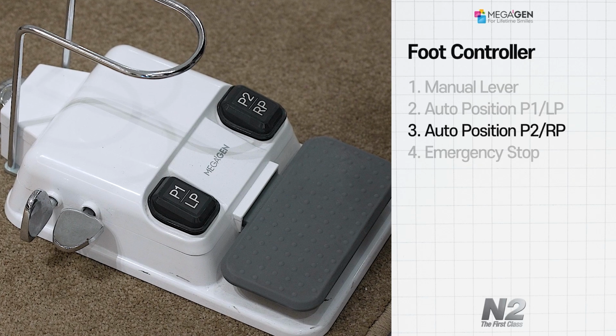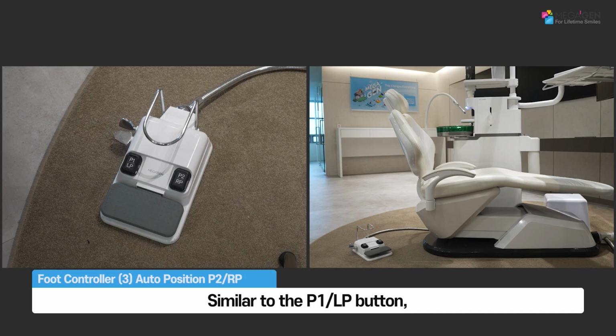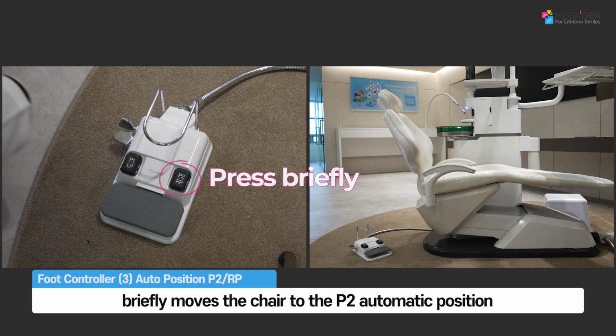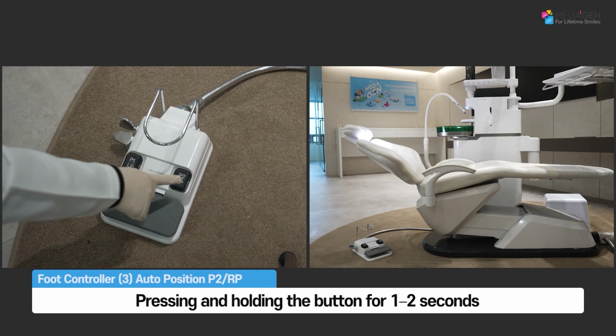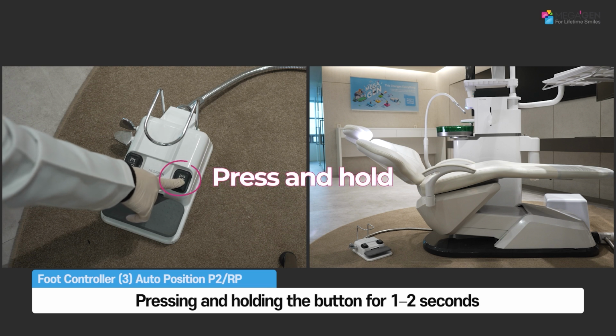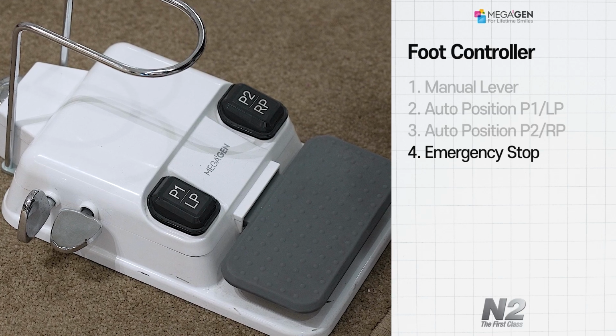How to use the foot pedal automatic position P2 RP buttons. Similar to the P1 LP button, pressing the P2 RP button briefly moves the chair to the P2 automatic position. Pressing and holding the button for 1 to 2 seconds moves the chair to the position immediately prior to the current one.